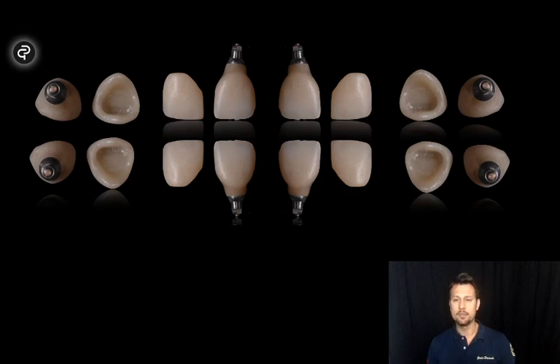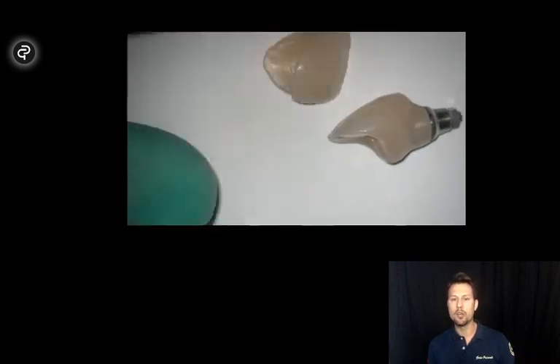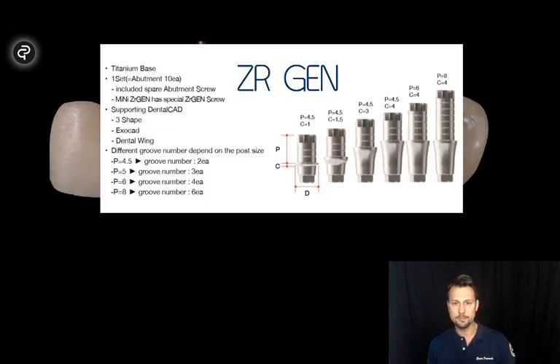So what we receive from the lab is milled zirconia, already colored, and it is free of models, because if we talk about monolithic or cutback, we are free of models, so there are no models produced. We just screw that in the mouth, and we need to link an abutment that is not a T-base, but with Megagen is a Zirgen.